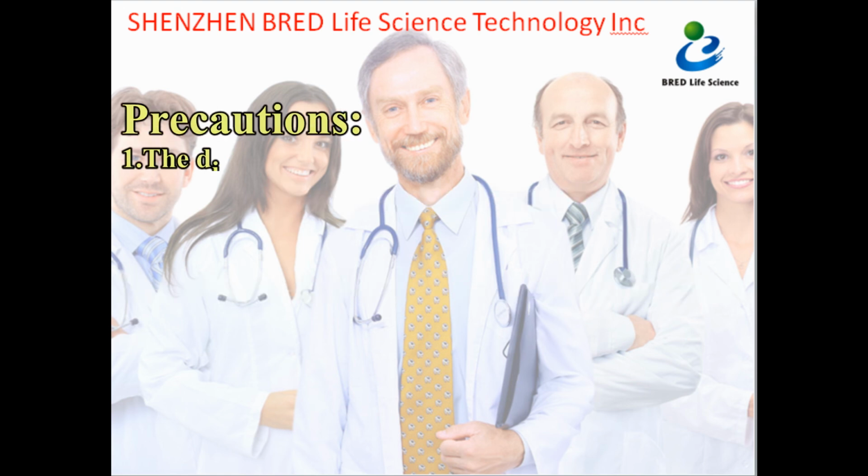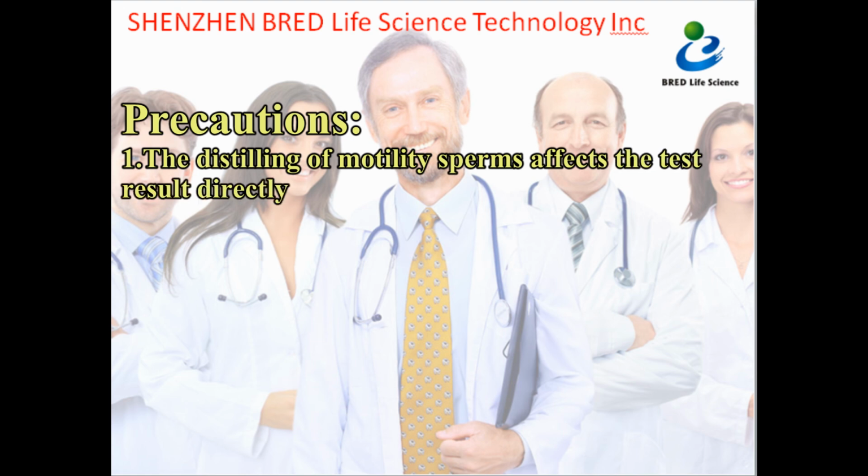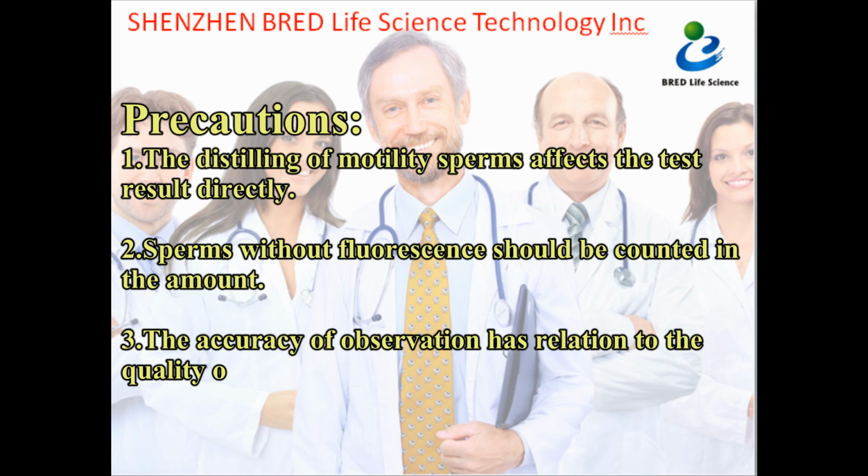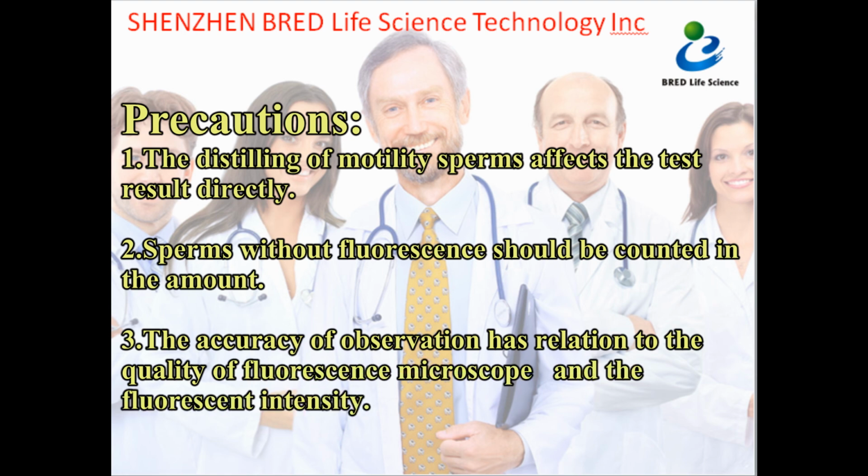Precautions. 1. The distilling of motile sperms affects the test result directly. 2. Sperms without fluorescence should be counted in the amount. 3. The accuracy of observation has relation to the quality of fluorescence microscope and fluorescent intensity.